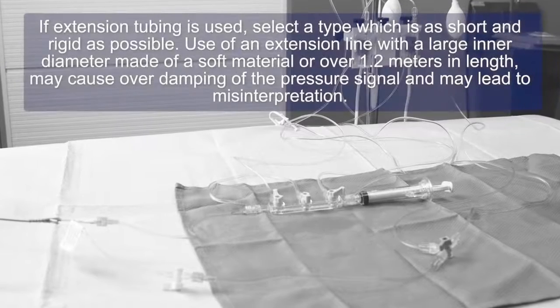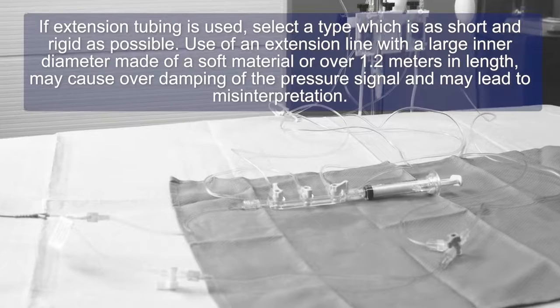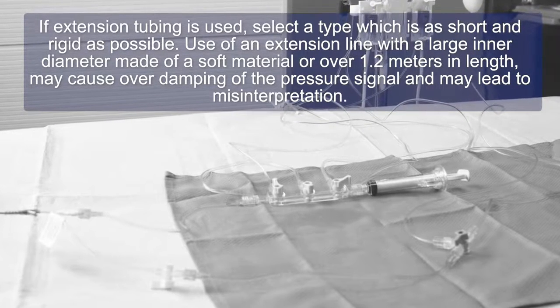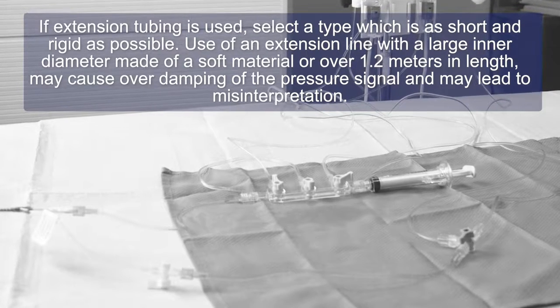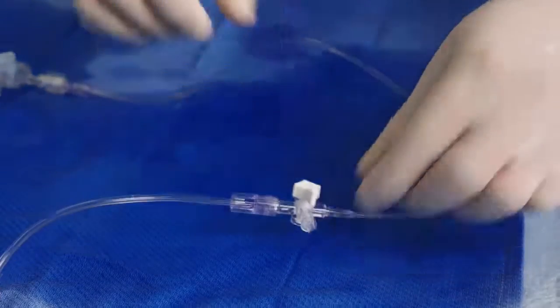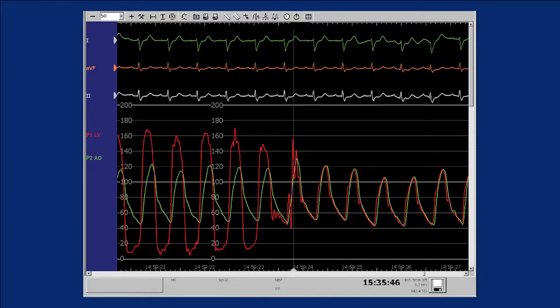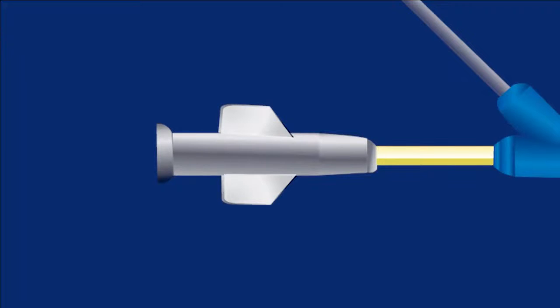If extension tubing is used, select a type which is as short and rigid as possible. Use of an extension line with a large inner diameter, made of a soft material, or over 1.2 meters in length may cause overdamping of the pressure signal and may lead to misinterpretation. Open the outer lumen stopcock and obtain measurements. Observe the simultaneous waveforms. The pressure gradient can be calculated and the degree of aortic stenosis can be diagnosed. Angiography may be performed as desired through the distal lumen.